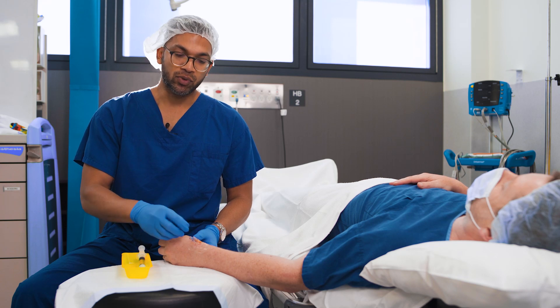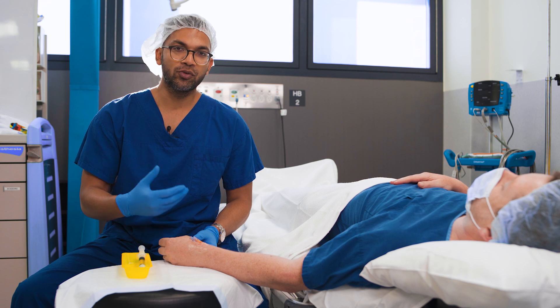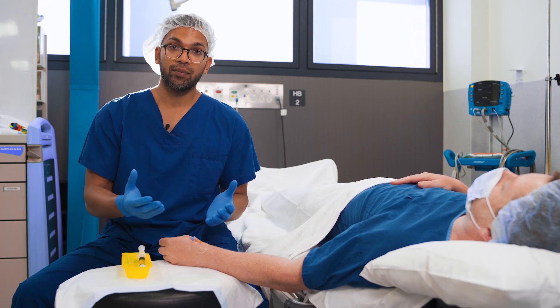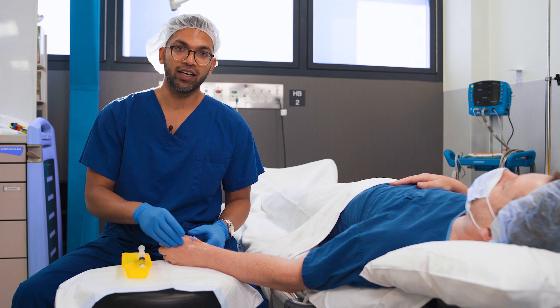A couple of really obvious things as well: when you're advancing the cannula it advances very smoothly, there's no resistance, and there's no tethering of the skin. If all of those things are happening with no issue at all, you can know with a lot of confidence that you're in the vein.